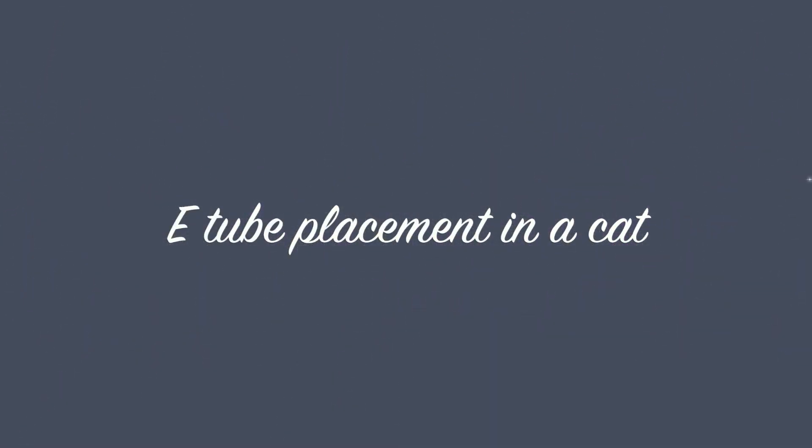Welcome to our video demonstrating esophageal tube placement in a cat. My name is Brent Higgins. This technique is really handy for managing animals that require increased nutritional supplementation before or after surgery.